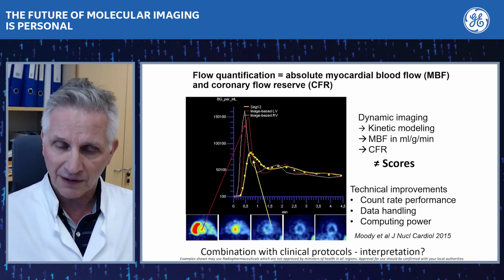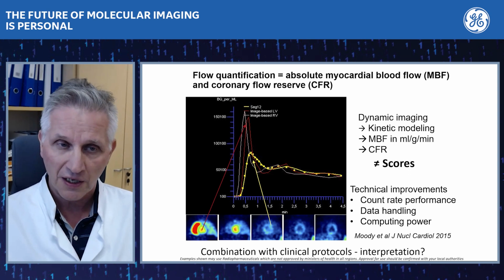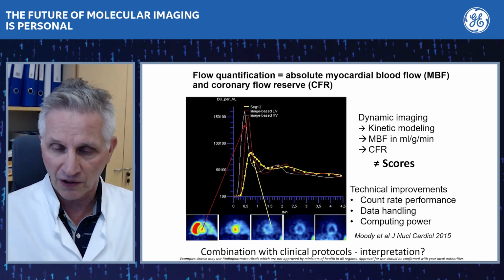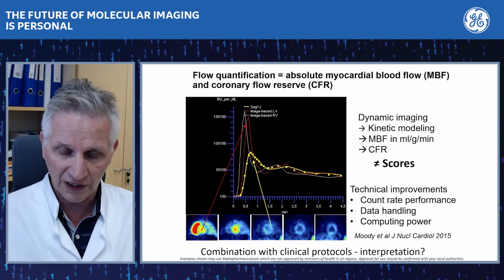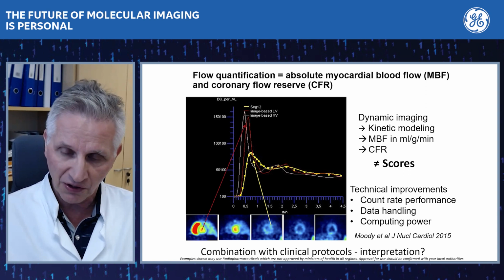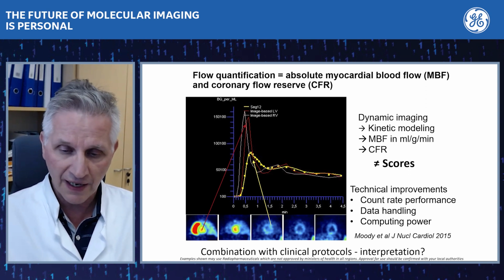Somebody may think that it is complicated to perform dynamic studies on a routine basis, but actually it is not. The dynamic studies performed with current scanners are very short in time, very rapid, and the post-processing of images as well as the full quantification don't take much time and resources, and are very easily applicable in clinical routine.